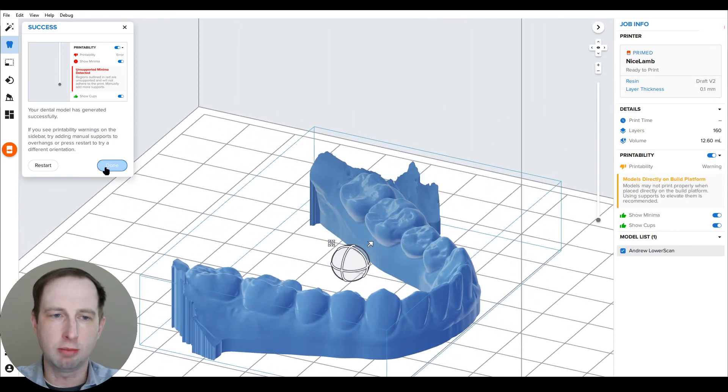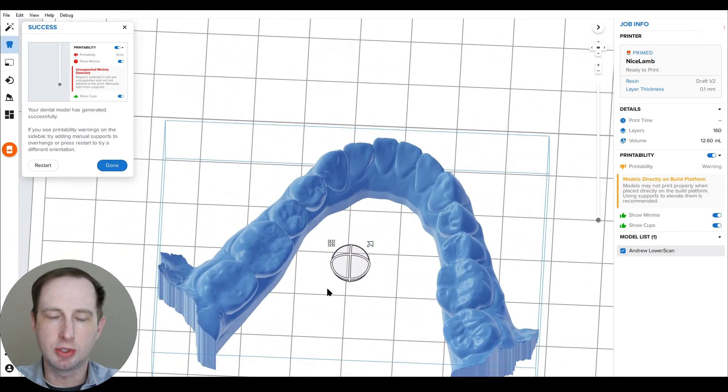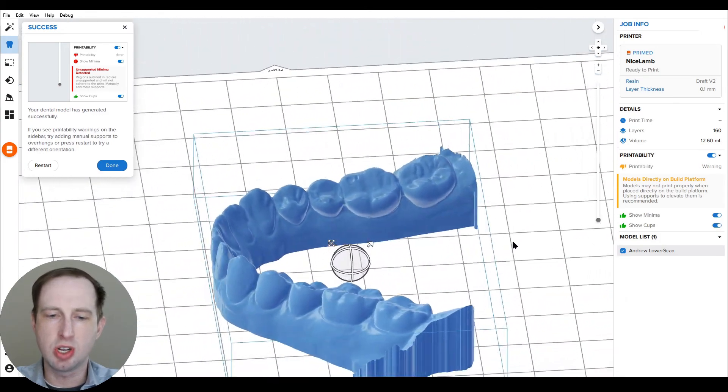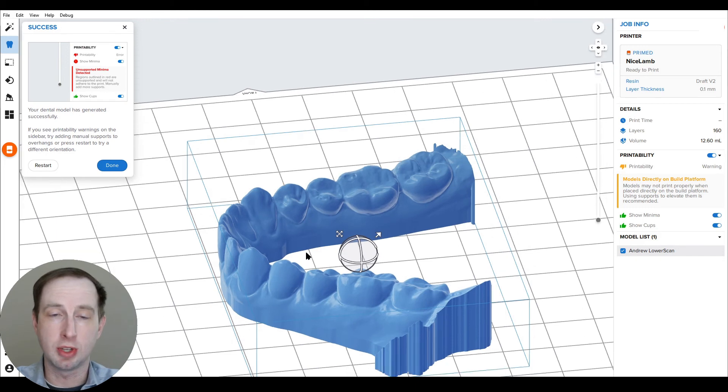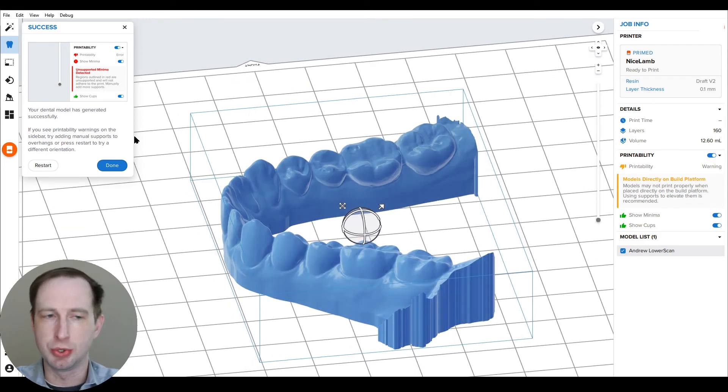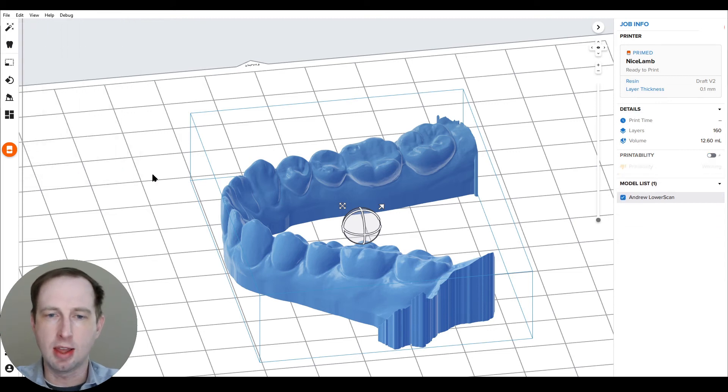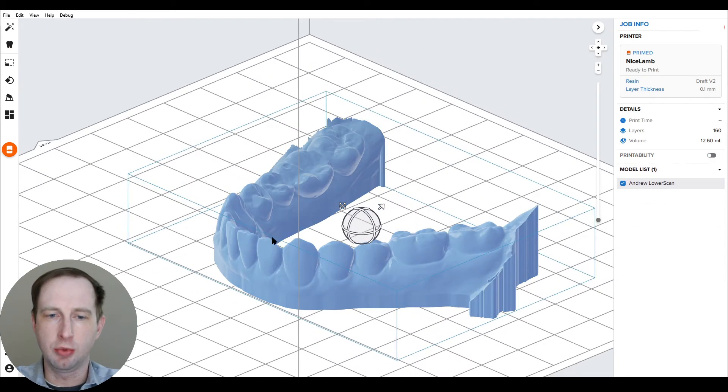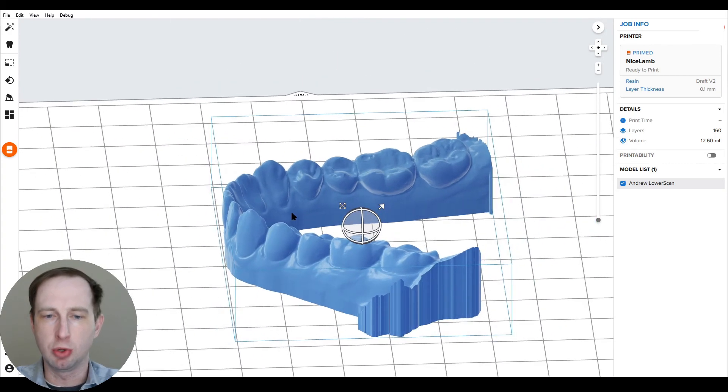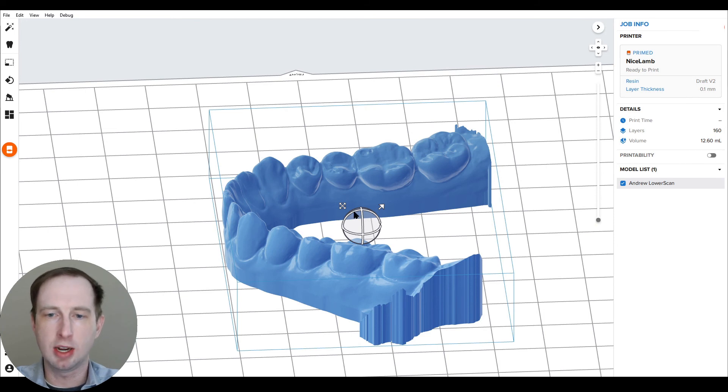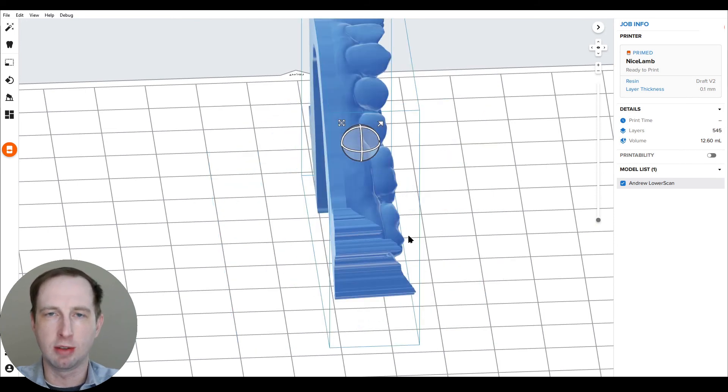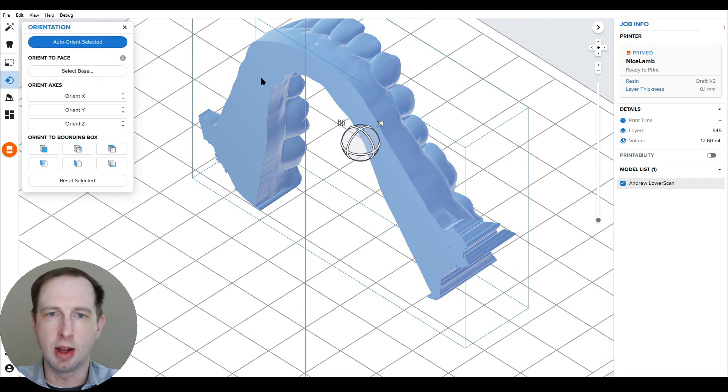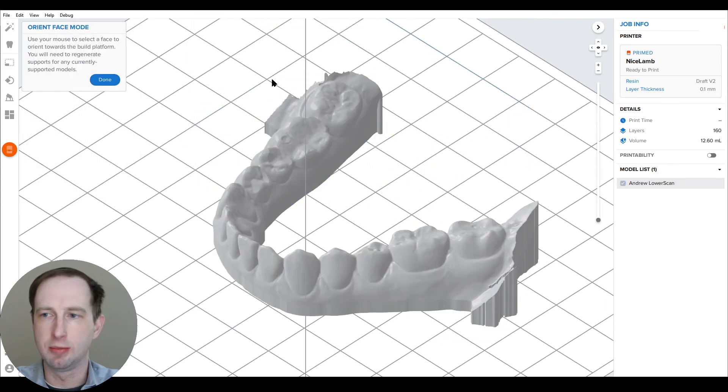So ideally review it, make sure it looks good. If you see any sort of extrusion issues or you reviewed and some critical anatomy is removed, you can always undo or hit the restart button. But once you hit done, you can treat it like any part or model brought into PreForm. You can print it right on the build platform for the fastest prints. You could position it or rotate it for a vertical print if you're doing lots of models all at once or anything you want like normal. This model is ready to be printed.